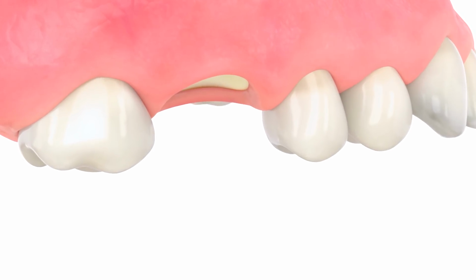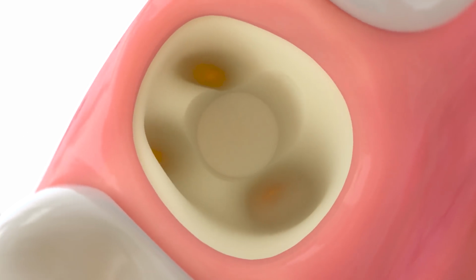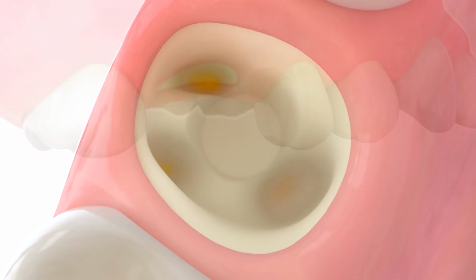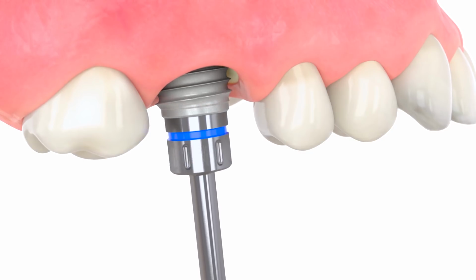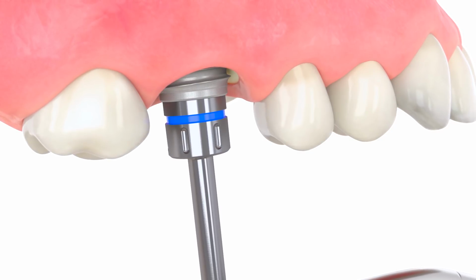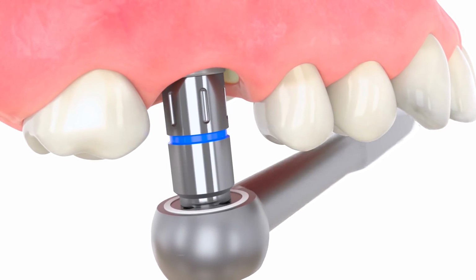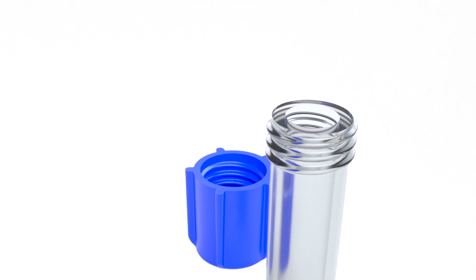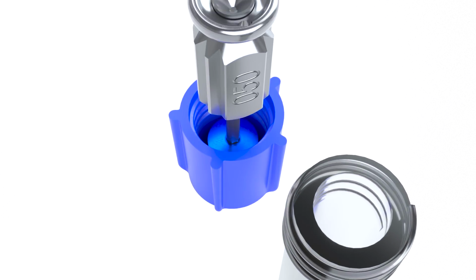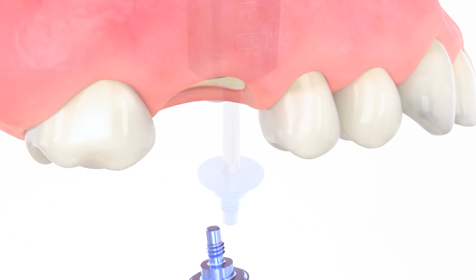Before placing the implant, check the extraction socket to confirm the remaining bony walls are intact and no cracks are present. Tapered IM implants can be placed with implant level drivers for the ratchet or handpiece. Remove the cover cap from the implant vial cap and place into the prosthetic platform using an 050 hex driver.